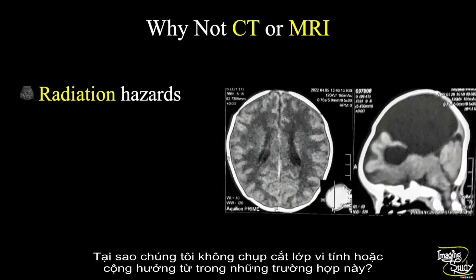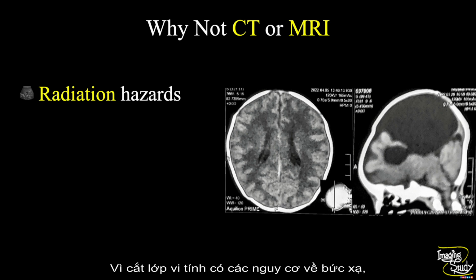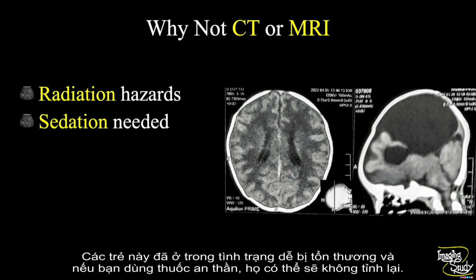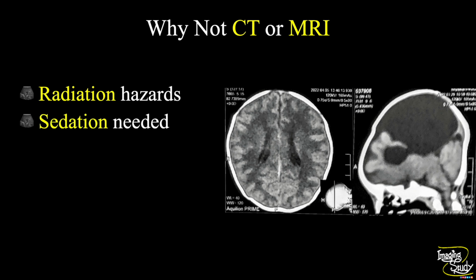Now another question that may come to your mind is why we are not doing CT or MRI in these cases. Well, CT has radiation hazards. For MRI, you may need sedation. These babies are already in a vulnerable state, and if you give them sedation, they may not return back. So it's quite difficult to do.